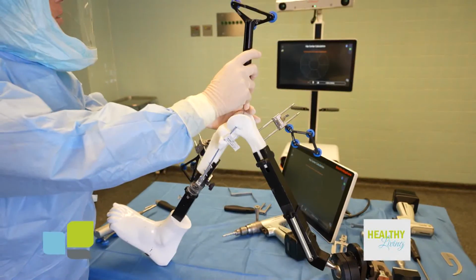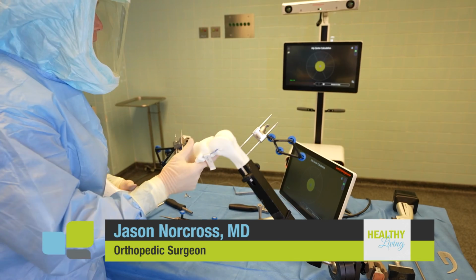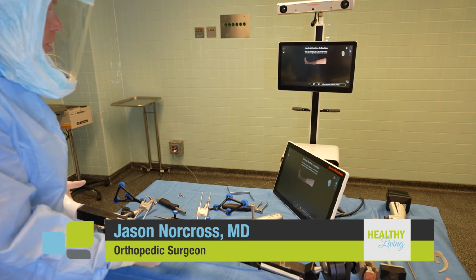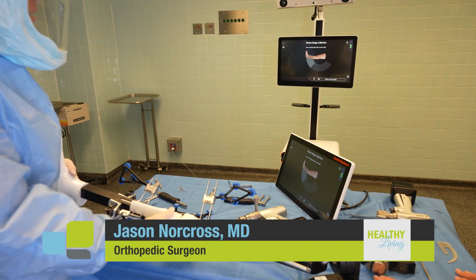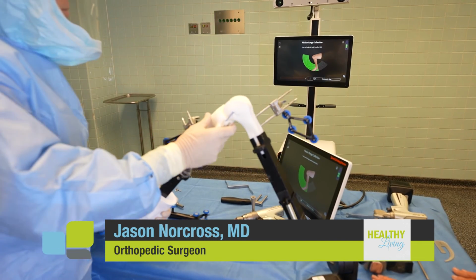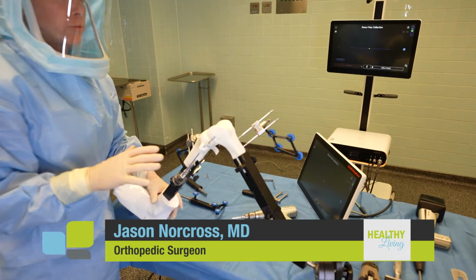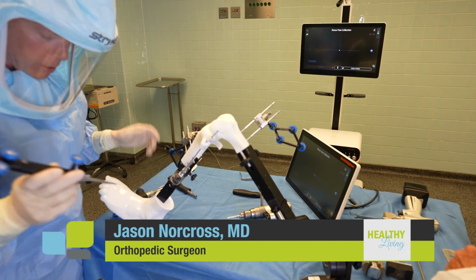And I imagine when you're working on a human being, like you said, everything is different. Every knee is different. Absolutely true. Okay, we just identified the hip center. Now we're going to give it some data points. This is full extension or the neutral position. And then I'm going to take this knee through a range of motion. Oh, look at this. So we're feeding the information to the robot so it can create an exact three-dimensional replica of that patient's unique knee. Wow. So now we're going to do our three-dimensional mapping.